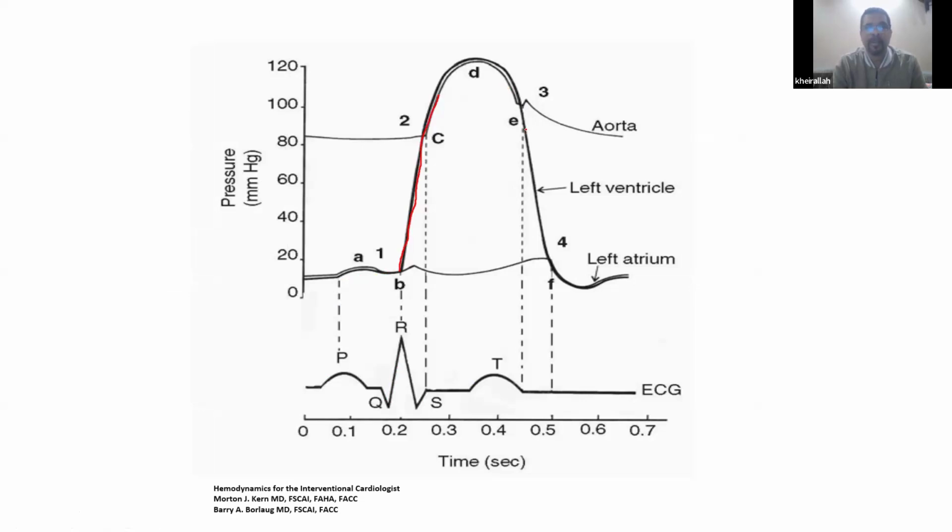Systole, and we come all the way down. This is all systole from here up until here. This is ejection time. So when you look at the ECG, you are in a systolic period. Diastole starts here. This is diastole. P is the last stage of diastole, preceded by the early stage, which is here. So we have a diastolic part and a systolic part.